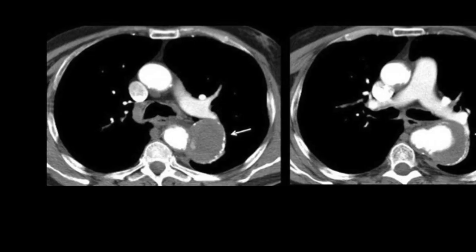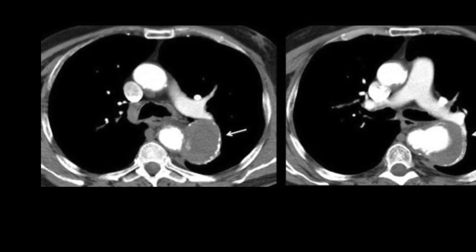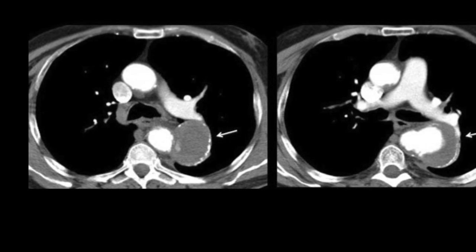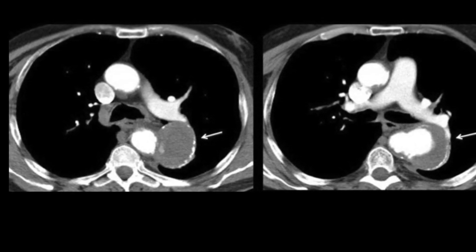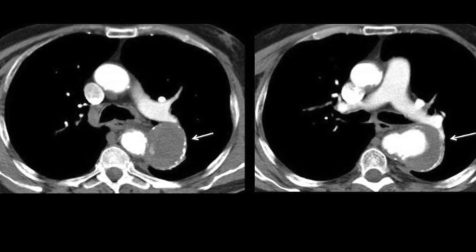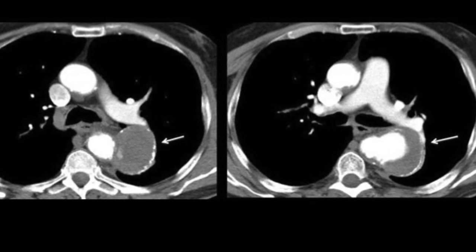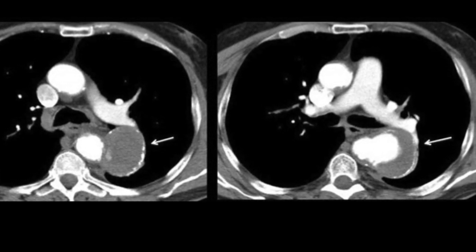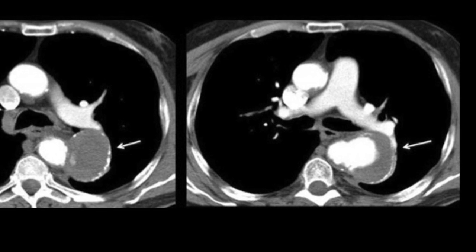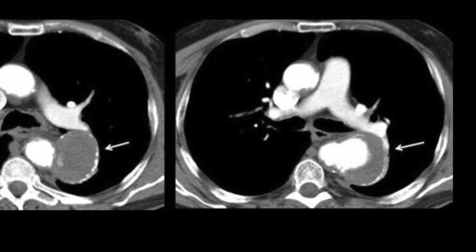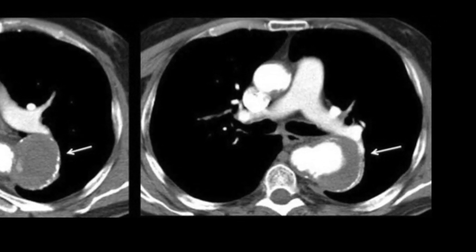On the CT scan of the chest, what we see is a well-defined saccular aneurysm arising from the descending thoracic aorta. You can see it here, clearly defined, with a circumferential thrombus sitting at the periphery of this lesion.